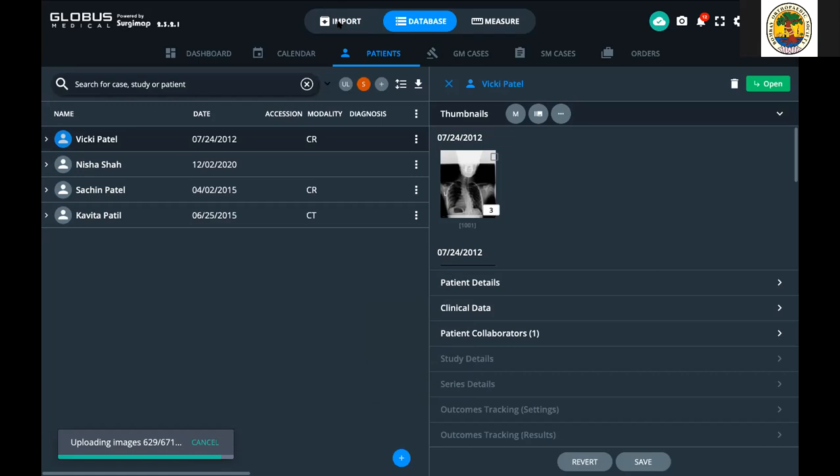So it puts the patient back into the same patient. You have to change the patient details. If you are taking the JPEG and the PNG files now, they don't have DICOM information in them. So you have to rename them.